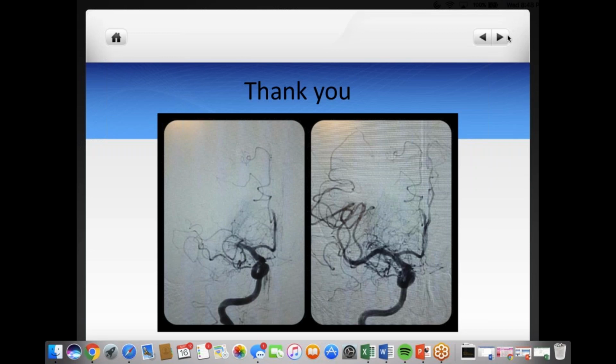Contrast staining, let's do that. Good question. There may be some susceptibility on SWI. I believe there are probably a couple of papers out there looking at that. But I wouldn't put much weight necessarily on the SWI, but I think definitely it will not look like blood. The FLAIR may help you as well, and the T1 may help you if you're doing post-thrombectomy MRIs, and definitely it won't bloom as much as blood.